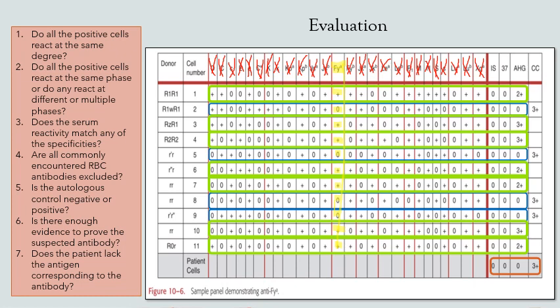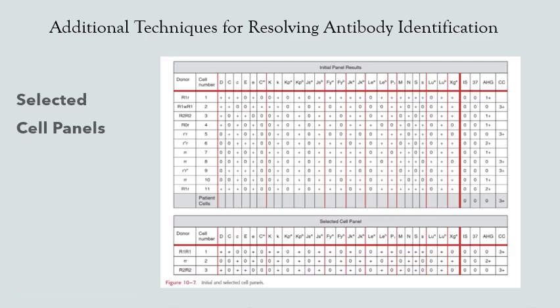So, this is how you will evaluate your panel screen, your sample panel, your panel rather. So, this is how you will identify the antibody.